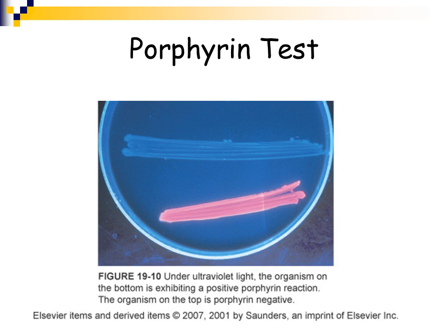The quad plate is not commonly done anymore with your MicroScans and your Vitek. You don't need to do as many manual tests, but there are some labs that might do some quad plate verification tests, or if the instrument is giving inconclusive results and you're pretty sure it's a Haemophilus influenzae.